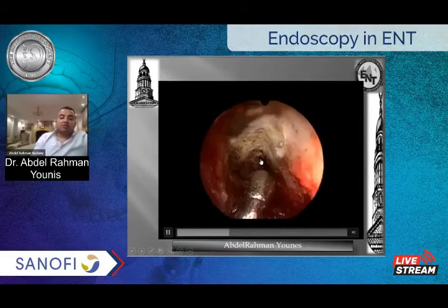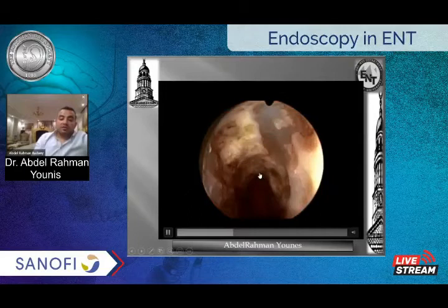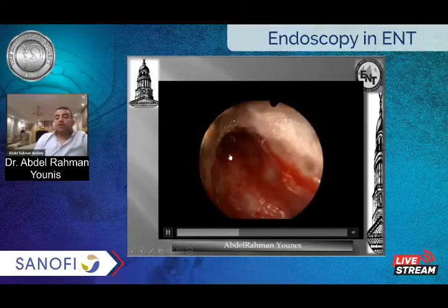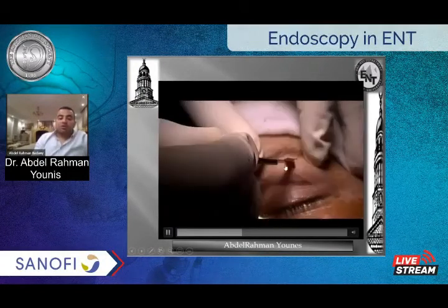You're gonna drill out to enlarge the frontal sinus ostium, but the problem here, you have a very narrow anteroposterior diameter.